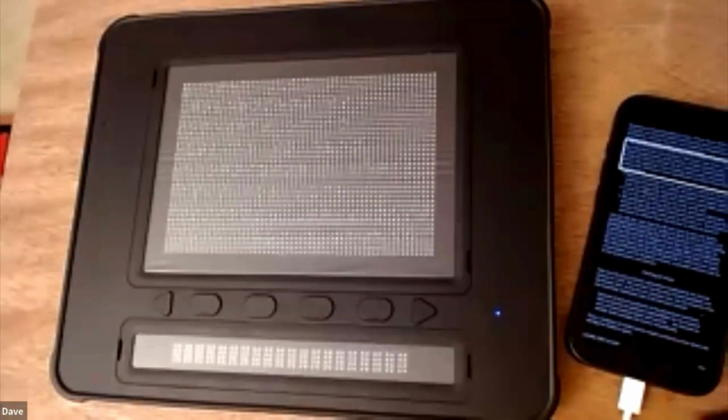You may want to go into the settings for your particular dot pad in the Braille settings and go to that more info and configure some of the buttons to add functionality that you use most frequently. For me, it was the Braille access, using the combination of buttons 2 and 3, and then check out some of those multi-line extras that you find in the rotor once you have connected to a multi-line Braille display.